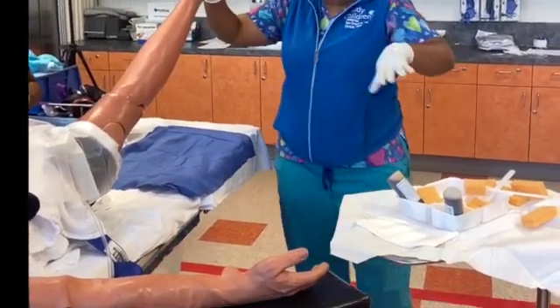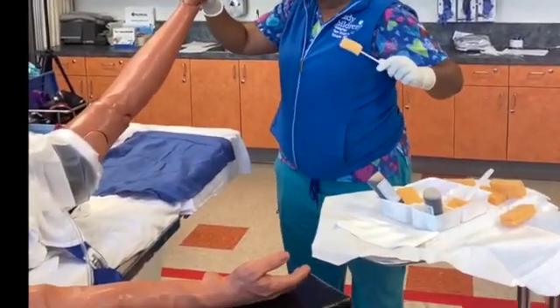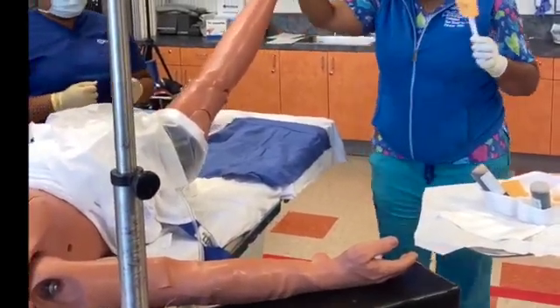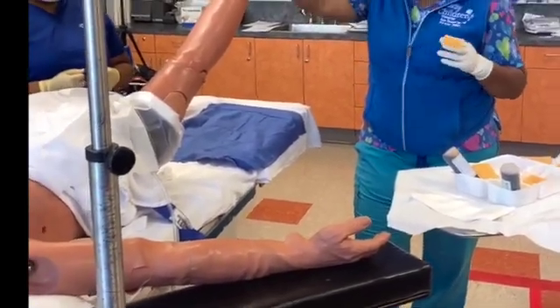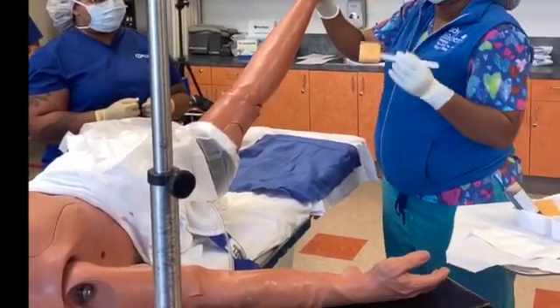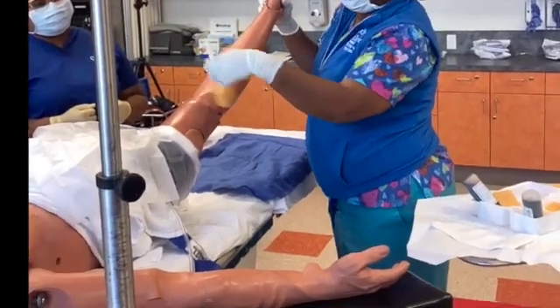Okay, did it contaminate anything so far? So the last thing you do, am I going ahead? Sorry, Abe. Go ahead. Student preps at the knee, continues around the circumference, and then moves to the upper and lower leg, away from the knee to the tourniquet and foot. Okay, so you've already done that. Gathers prep supplies and discards them in the appropriate receptacle. So I painted. All right, scrubbed.